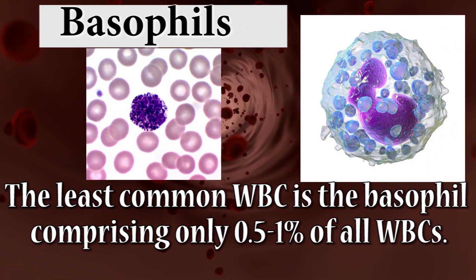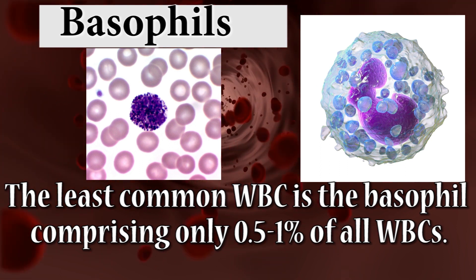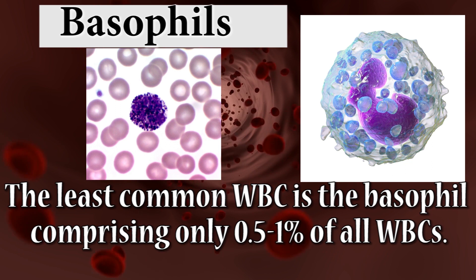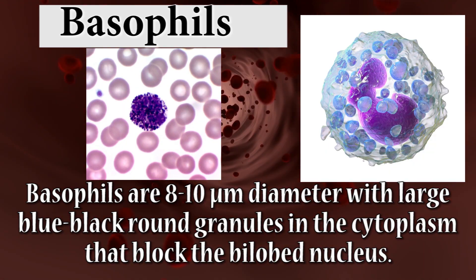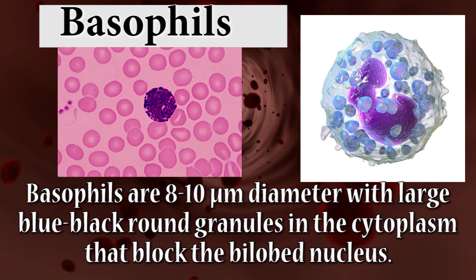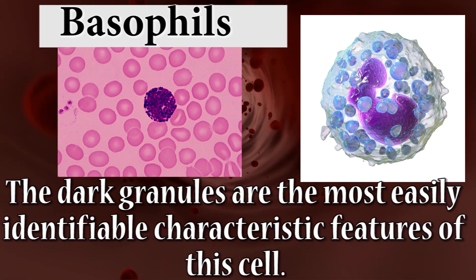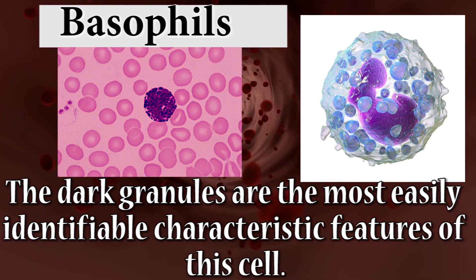Basophils are the least common WBC, comprising only 0.5 to 1% of all WBCs. Basophils are 8 to 10 micrometers in diameter with large blue-black round granules in the cytoplasm that block the view of the nucleus. The dark granules are the most easily identifiable characteristic features of this cell.